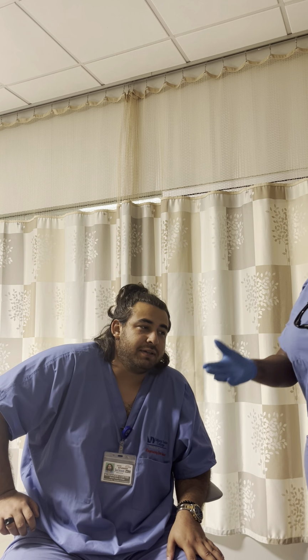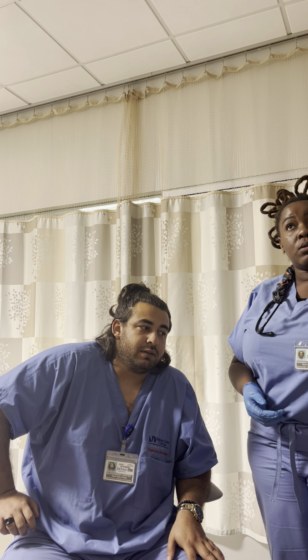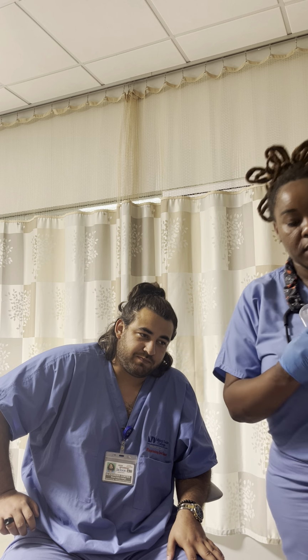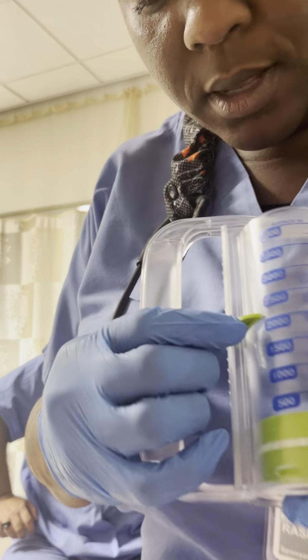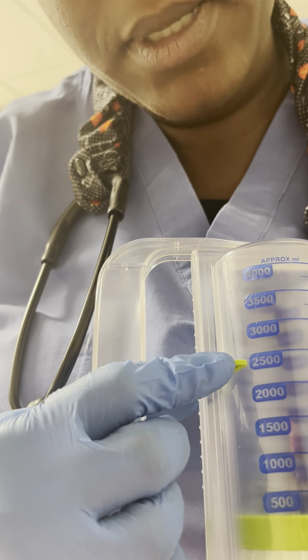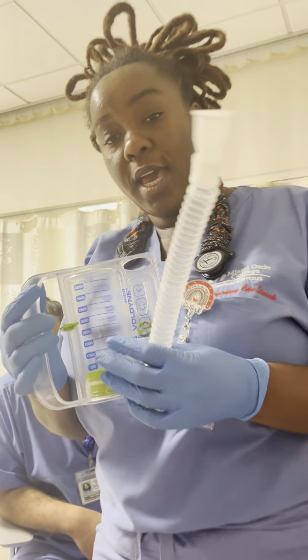So now we performed this on the patient. Now, if you want to challenge the patient, you could move this up a little bit. Okay. You can add more volume to it to give the patient a little challenge. Okay.